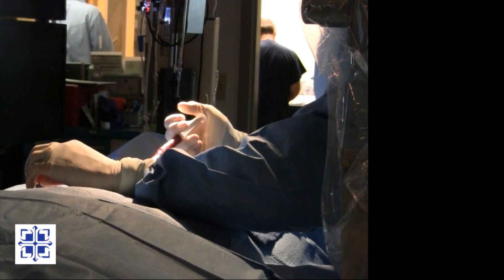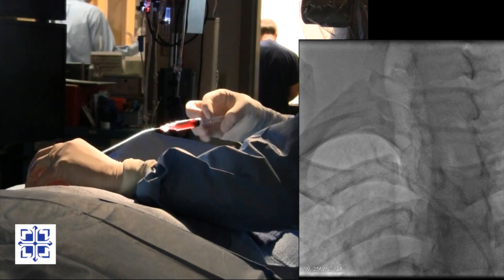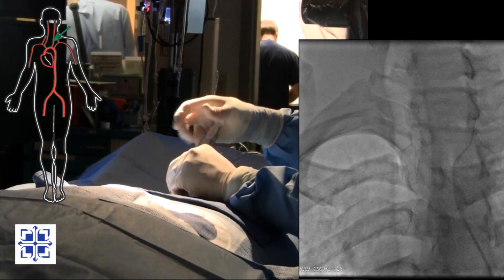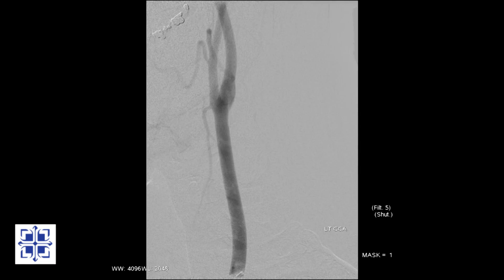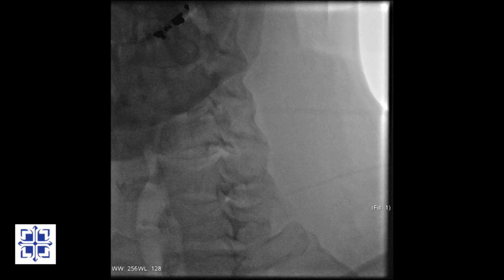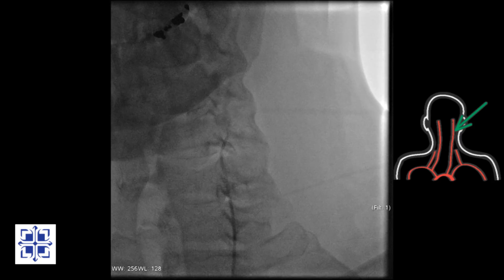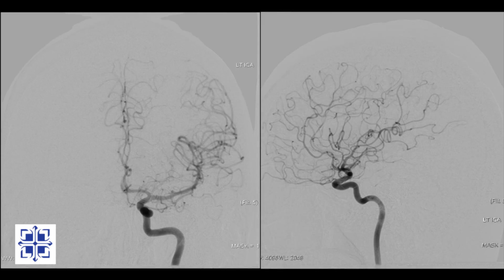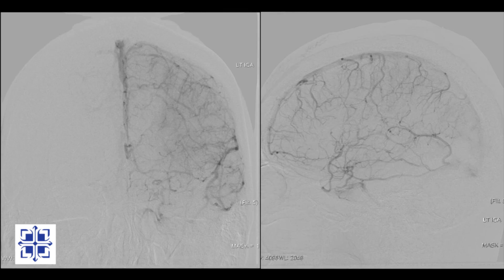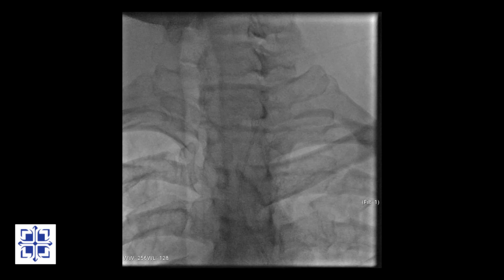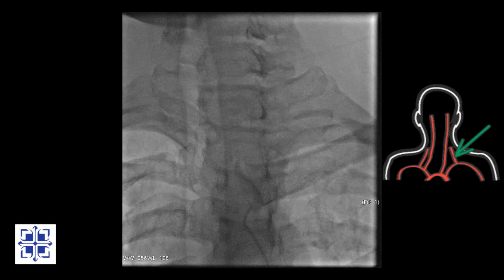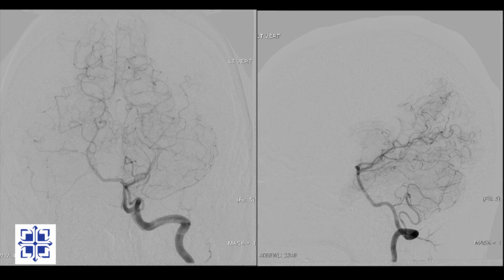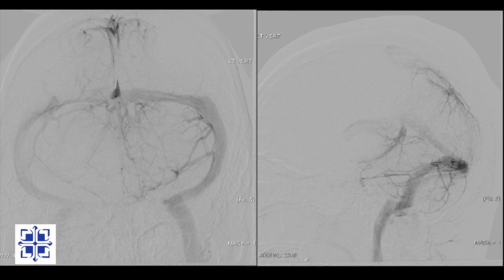Now I am moving the catheter to the left carotid artery. This young patient has unusually straight and very healthy blood vessels, so I am not using the wire to reposition the catheter. I am injecting contrast and we see a picture of the left common carotid artery. I advance the catheter to the left internal carotid artery so we can view the blood vessels of the left side of the brain. I am injecting contrast and here we see the simultaneous views from both x-ray cameras. I am repositioning the catheter to the left vertebral artery so the vessels of the back of the brain can be imaged. I inject contrast and we see the blood supply to the back of the brain, concluding the cerebral angiogram.